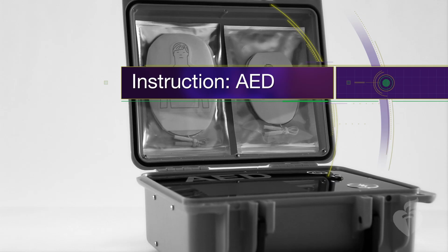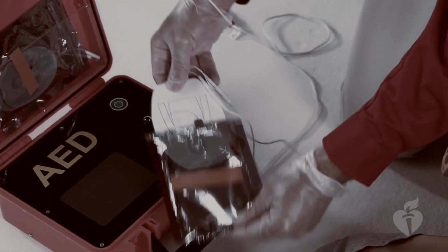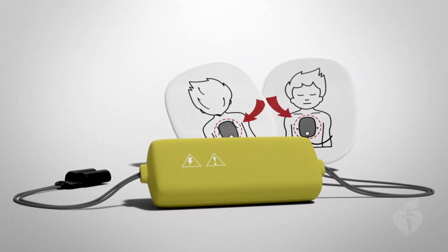Now, let's focus on the use of an AED. You'll need to familiarize yourself with the AED device that you'll be using today for your training class. There are some differences for the use of an AED for infants and children under 8 years of age. Some AEDs can deliver either an adult or child shock dose. The child dose is used for children under 8.